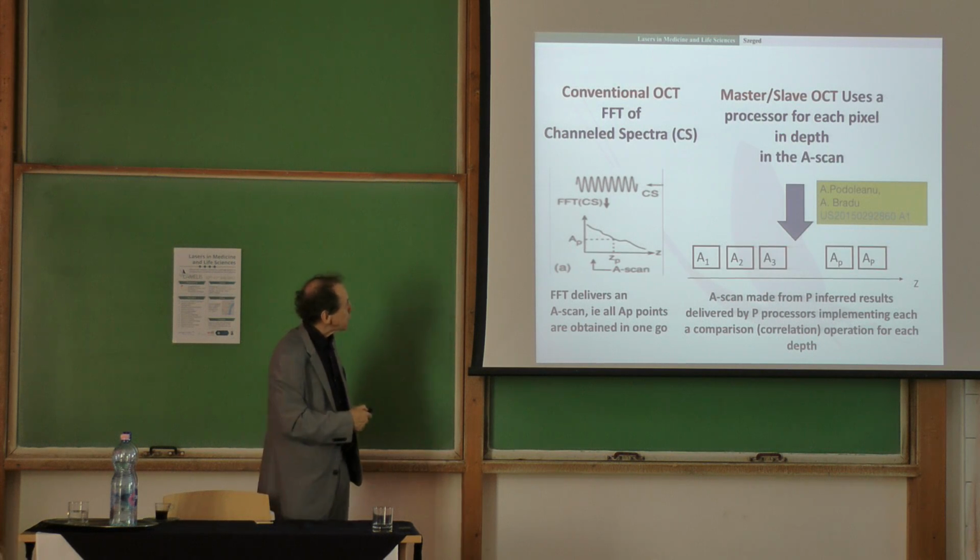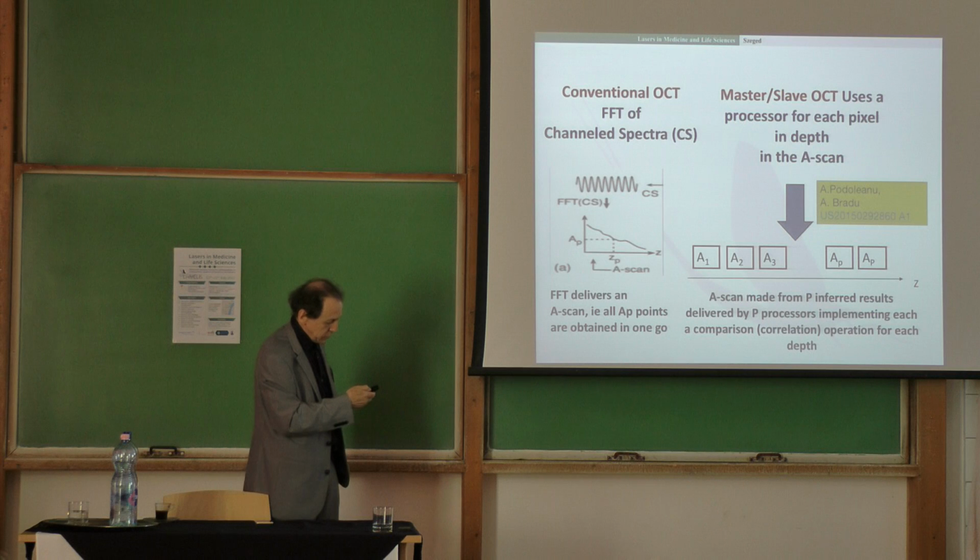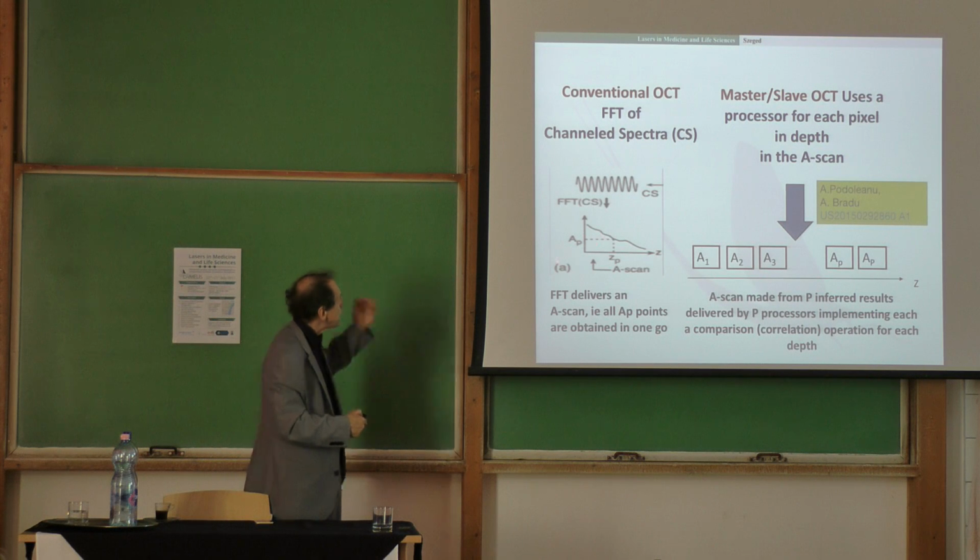So I would invite you to read from our webpage a new method which is called master slave, which is explained here. And that will be the end of my presentation. So that's novel technology coming here.